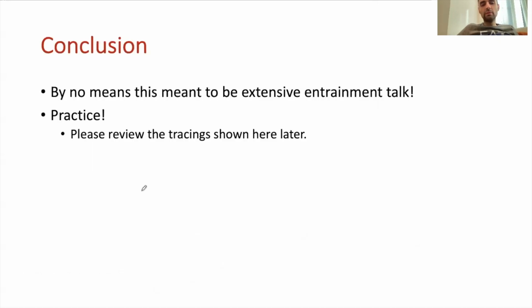Okay, thank you very much. It's a long lecture, but hopefully it was useful. It was by no means meant to be an extensive entrainment talk, but it's the beginning. With experience, you build on this talk. You have to practice so much, and please stop the video and review the tracings, because I went very fast because of the time constraints. Okay, thank you very much.